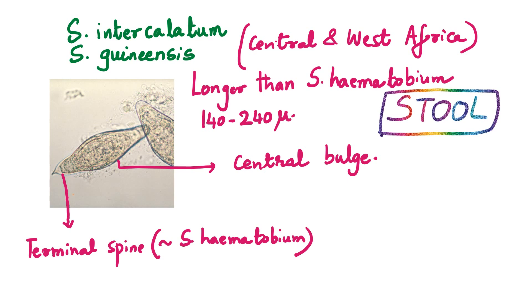Lastly, two species reported only from Central or West Africa: Schistosoma intercalatum and Schistosoma guineensis. The eggs are elongated with a terminal spine, similar to Schistosoma haematobium, but these eggs are found in the stool. You can appreciate a central equatorial bulge in the eggs of these two species, and they are also slightly longer — 140 up to 240 microns in size.